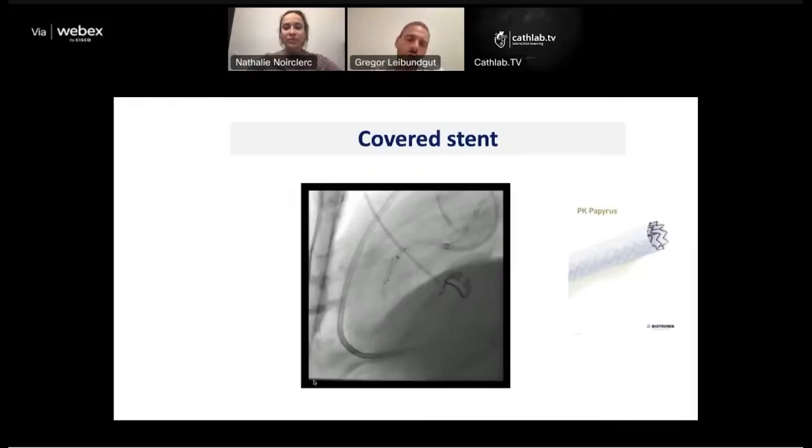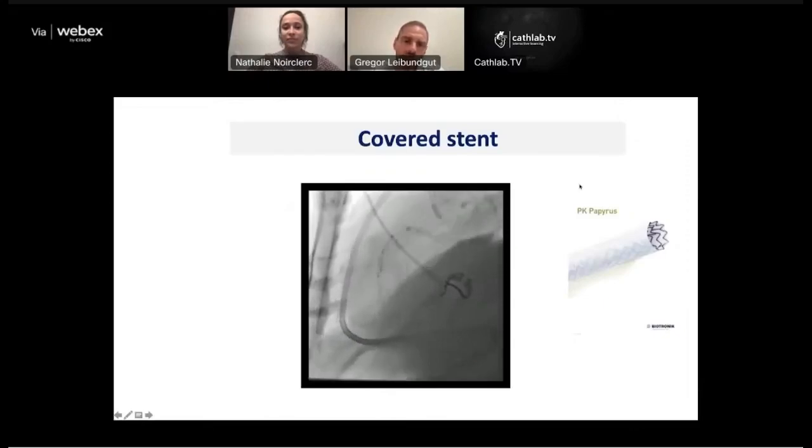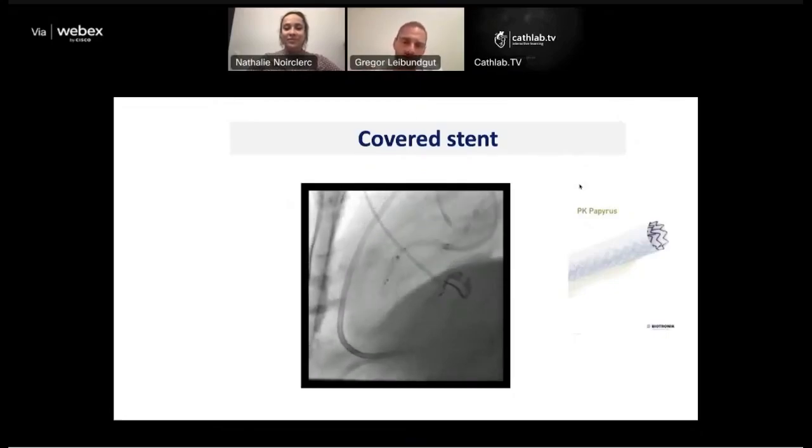And then you could also, if you need time to place the graft, take the blocking balloon back and block the inflow in the proximal RCA. Then you have a little bit more time to place the stent. But it's tricky, and as you show, you can easily lose all your gear and equipment. And in a big rupture, if you have to rewire this vessel, it could be very dangerous because sometimes you don't even find the distal target anymore, and you end up outside in the pericardium with your wire.